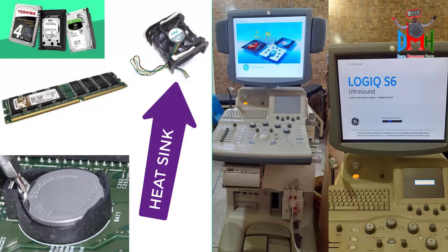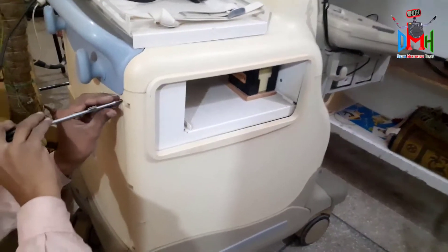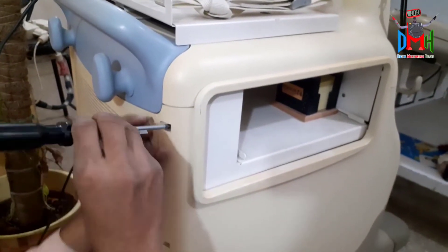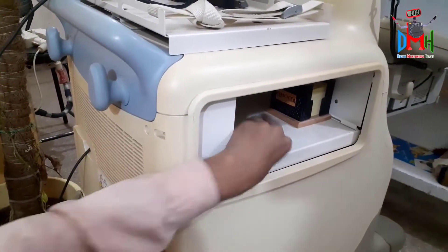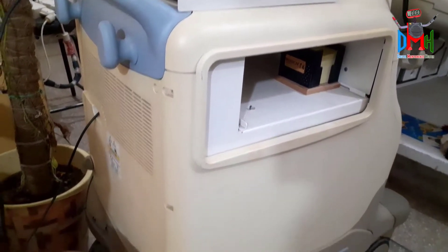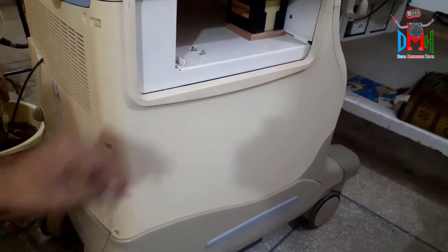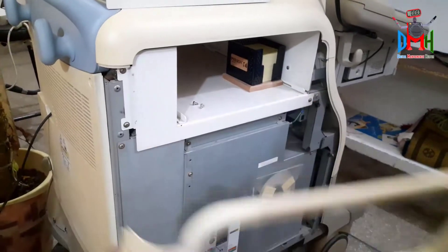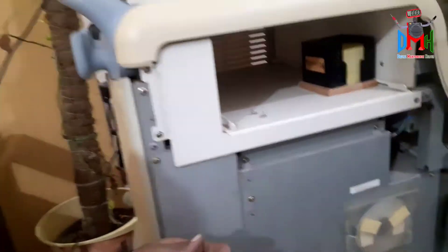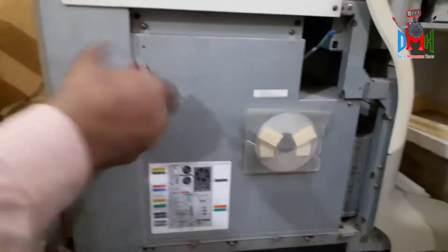First of all, remove the left side cover. Now open the screws from the back side of its cover with the help of a screwdriver. Then open the cover. Now open the small steel cover and then the big one.